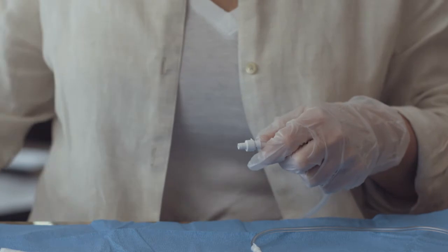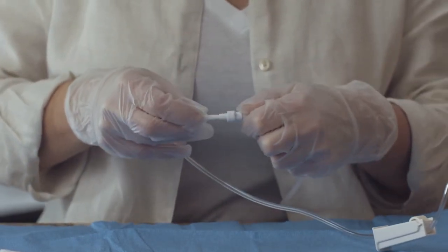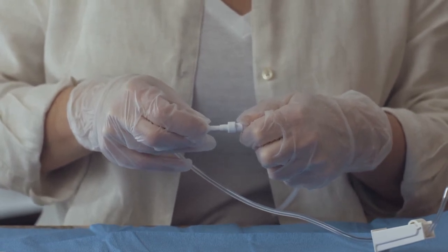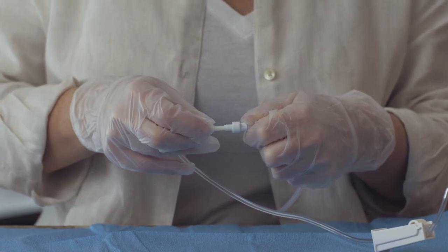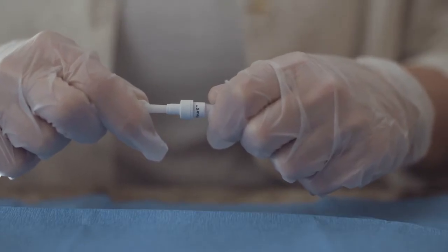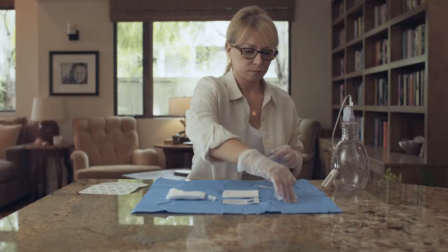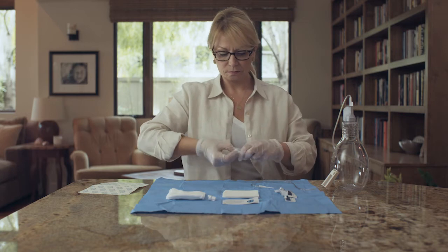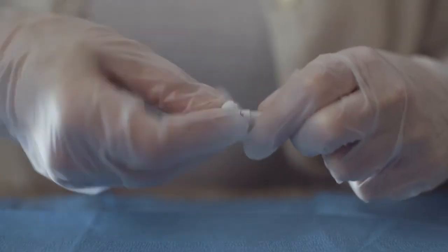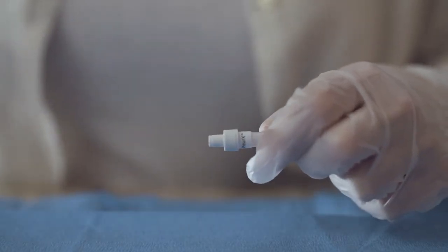While holding the catheter, pick up the drainage line near the access tip and gently insert the tip into the end of the catheter. You may feel and hear a small click when they securely connect. Make sure that the valve and the access tip are securely connected when draining. If they are accidentally separated, they may become contaminated. If this occurs, clean the valve with an alcohol pad and use a new drainage bottle to avoid potential contamination. Do not tug or pull on the drainage line.